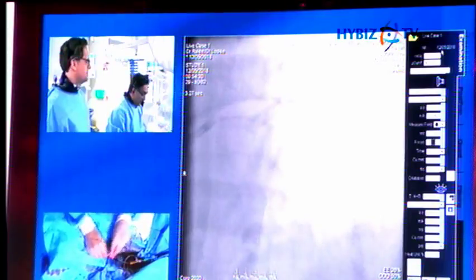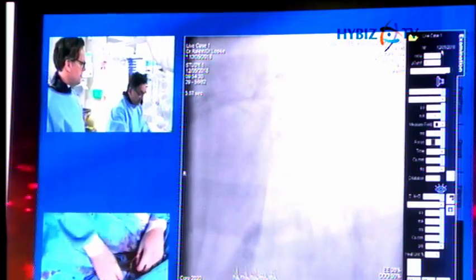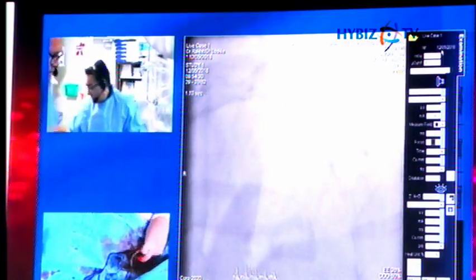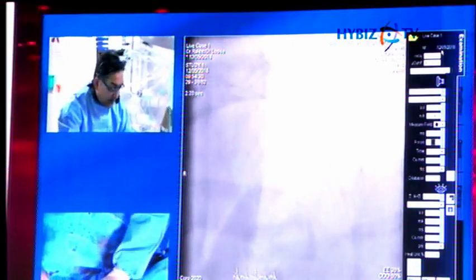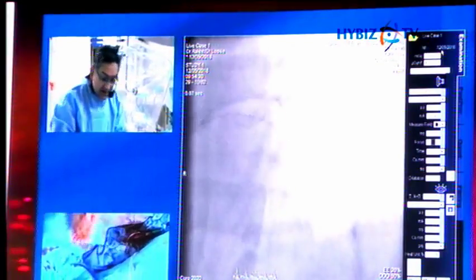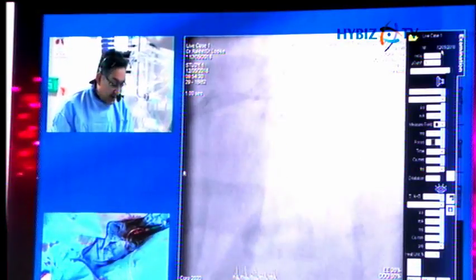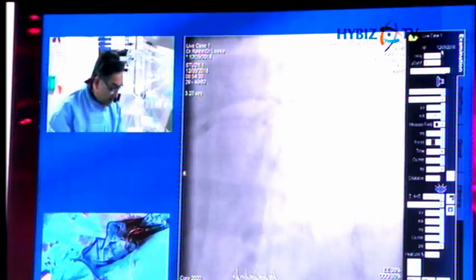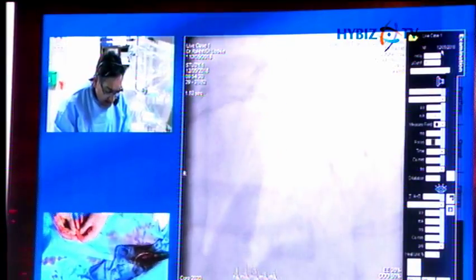So we're going to quickly put the OCT catheter down and show you what it looks like, and hopefully convince you that the apposition is pretty good. In the early days, we put a lot of these in and we were quite paranoid, doing OCT follow-up on all of them at 6 months. What we've learned is that they do actually accommodate to the vessel where the vessel's been very big, which surprised us.